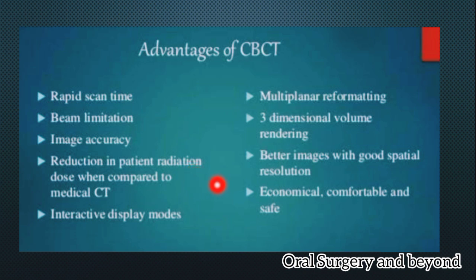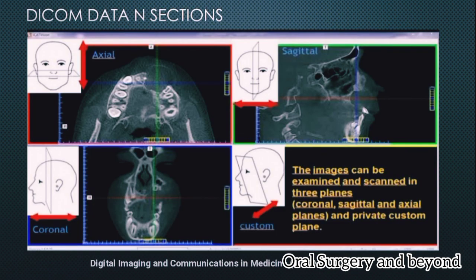Then interactive display modes are available, so when you are doing scans, you are able to see the exact scan formation and 3D reconstruction on the computer. Multiplanar reformatting is also available. Three-dimensional volume rendering and 3D reconstructions are possible due to new computerized software. Better image quality, better visualization, and ultimately better diagnosis is possible.